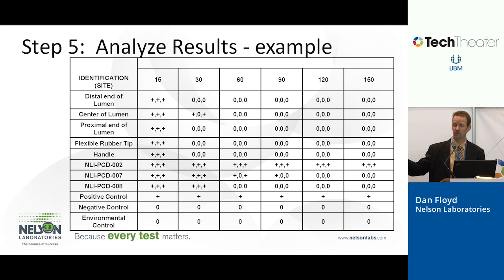And sometimes people will choose ones that are way more difficult than their actual product. What that'll do is give you more flexibility down the road. If you design a new harder product than this particular product, you can adopt that into your sterilization process without having to go through and totally revalidate that. And so it makes it easier. The downside is you may have a longer cycle than you would otherwise need. So it's a little bit of a balance of how much overkill do you want in order to be able to add new products down the road, versus how short do I want to keep that process and how optimized do I want it.